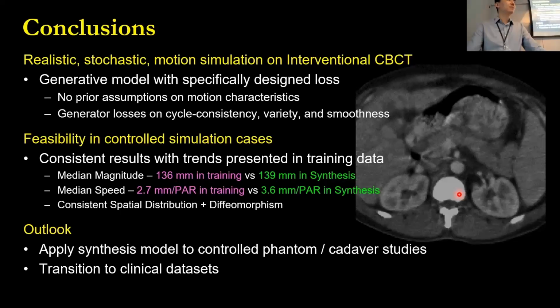I have a follow-up question on this topic. You're saying that you trust that the network will learn the motion from the real data. It seems to me that what you're actually trying, and very well doing, is to reproduce the motion that you have input for the training. But this motion model is very simple for the time being. So I think it would be a good idea to indeed use real data to estimate motion and input that to your simulator. Thanks for pointing that out.